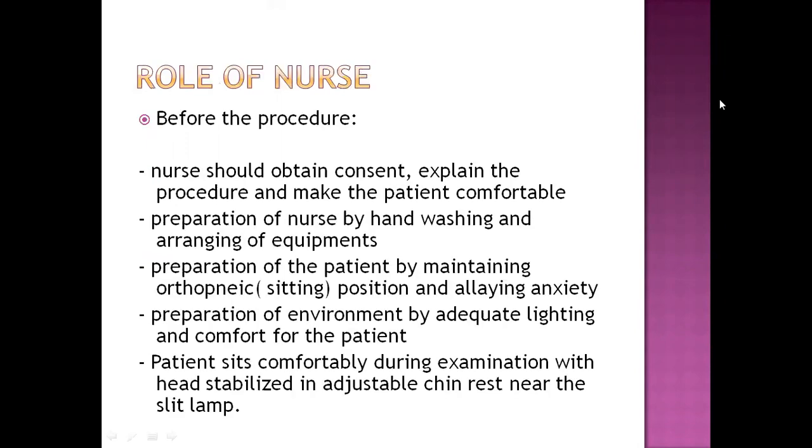The indications for this procedure are glaucoma, retinal detachment, dry eye syndrome, and cataract. There is a contraindication for this procedure, that is recent eye surgery. Any person who has just undergone recent eye surgery, it is not safe to perform this procedure on that patient. Now, role of the nurse.